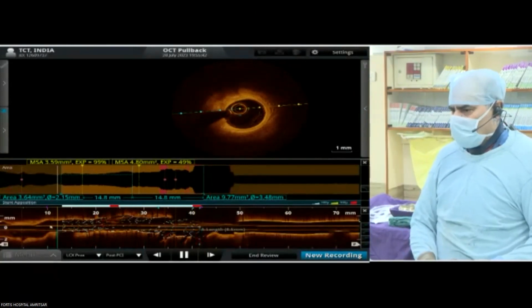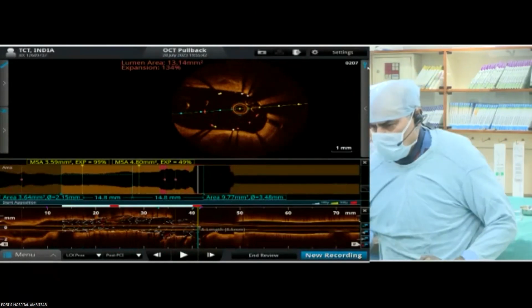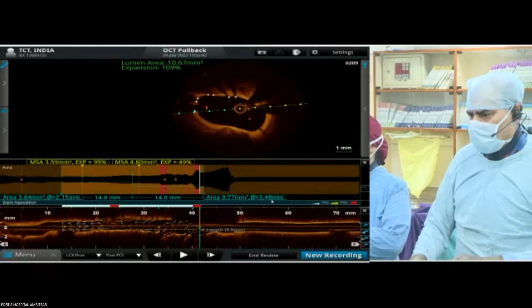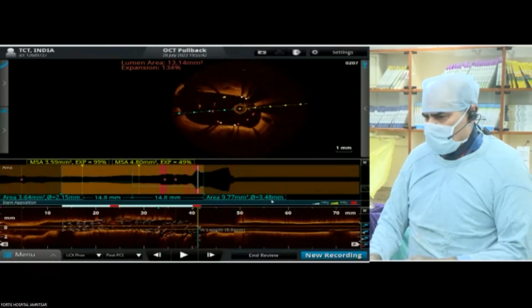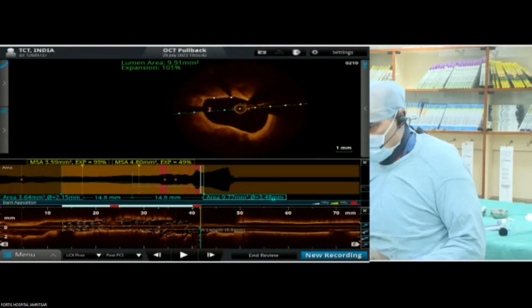Actually, we have seen this in this case. Yes, one minute, Manish. Let us see the strut and then come back to you. So here it seems that it's definitely across the struts and a bit more. You can see one image, the red 1.4 millimeters. See the malposition there at 4 to 6.